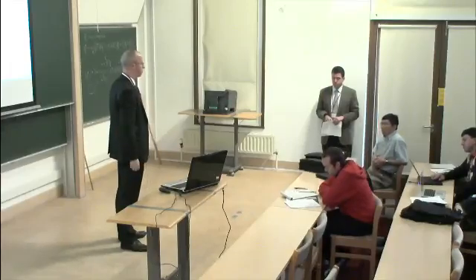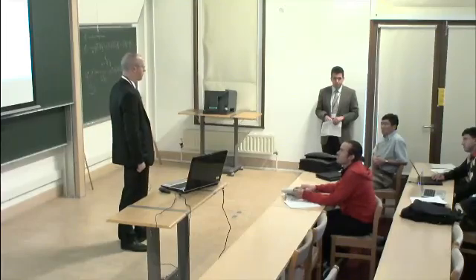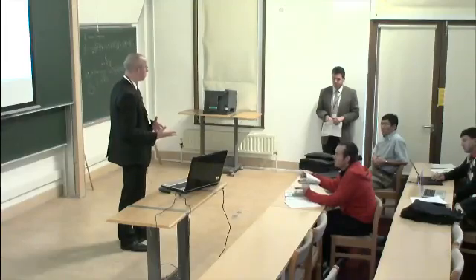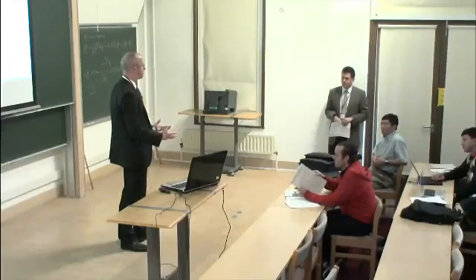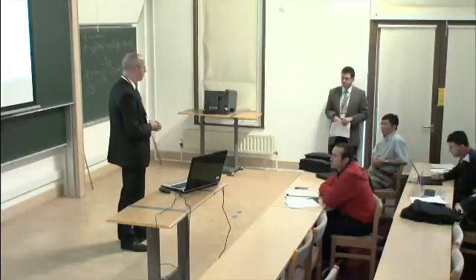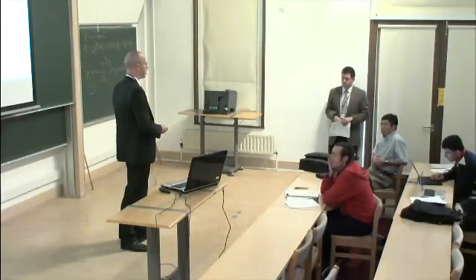What about a dual energy approach? Great question. There's a lot of interest right now in CT colonography in dual energy, particularly for patients who are maybe a little bit older and can't deal with all of the laxatives that are given, as well as just in clinical practice, things are moving to a laxative-free preparation. So by using dual energy, it becomes a little bit easier to reason about what is stool in the colon and what is not stool.